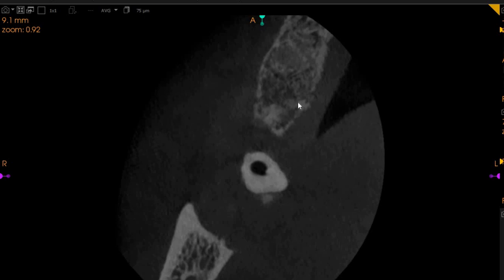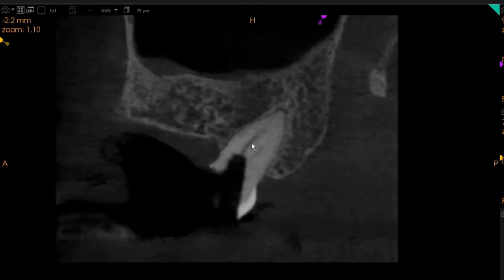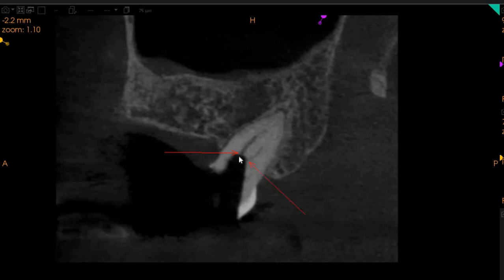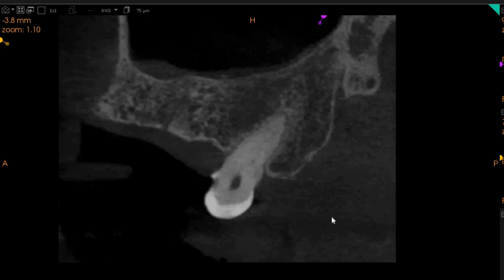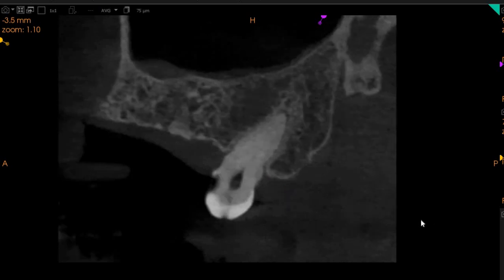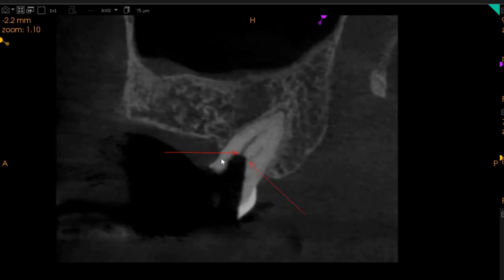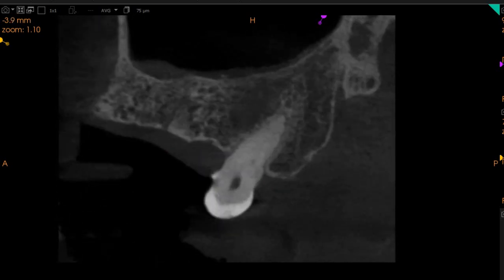Now we're going to show you this from a sagittal view. From the sagittal view, this is the mesio-buccal and this is the disto-buccal — both exactly where you have drilled. As we move a little palatally, this is the palatal canal right here. It starts right here, so it's slightly sclerosed but it is present.